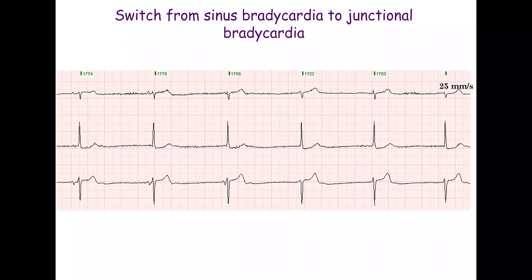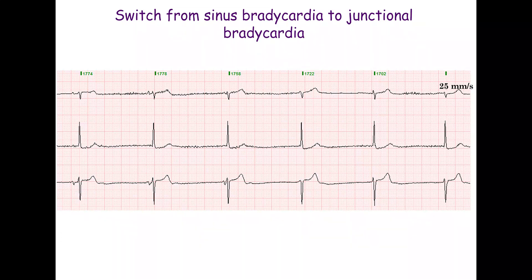The first QRS complex is of sinus origin. The PR interval before the second and third QRS complexes is shortened, indicating junctional escape. All QRS complexes except the first are junctional.